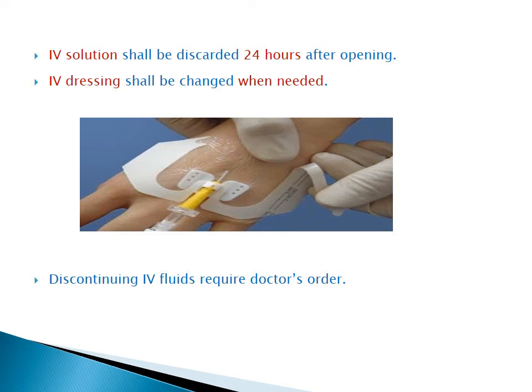For the IV solution, this shall be discarded in 24 hours after opening. IV dressing shall be changed when needed. Nurses should bear in mind that IV therapy is a dependent function. Thus, discontinuing IV fluids requires a doctor's order.